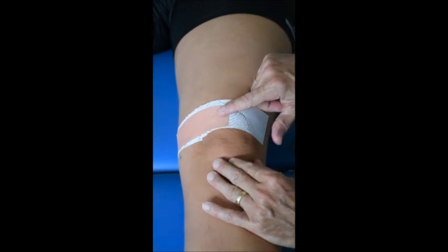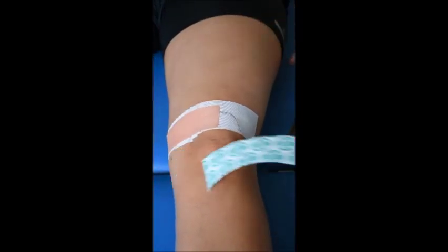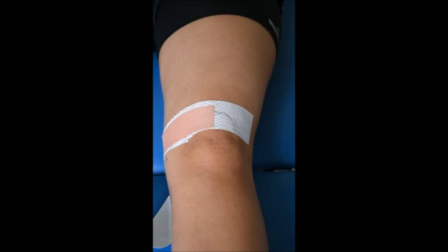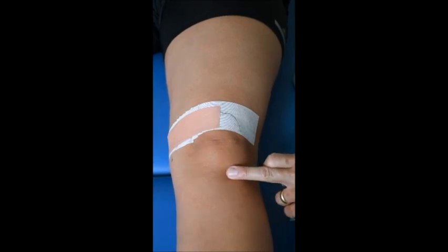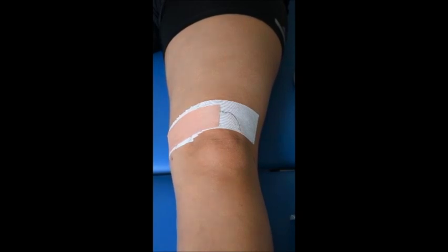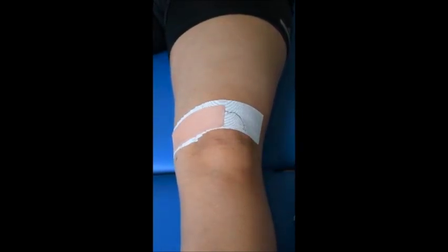Once we perform this tape, we need to do what we call the unload of the fat pad. So together with this tape, we need to place 2 more tape to unload the fat pad which is here. Make sure you start just below the fat pad, which means more or less close to the tibial tuberosity. We place 1 tape on the lateral aspect of the patella, meaning starting at this point, more or less 2 fingers below the apex patella.